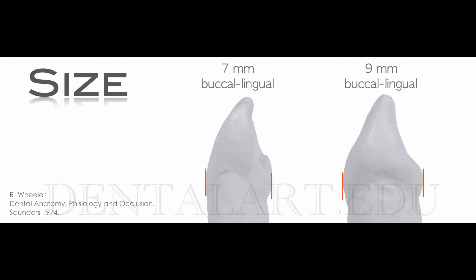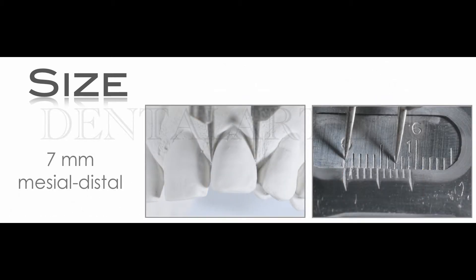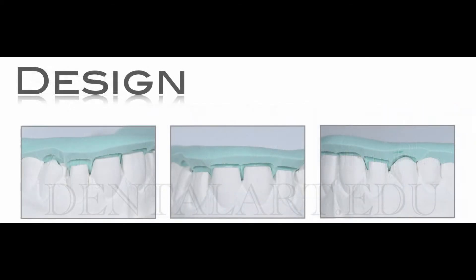We have to play more with the labial area since they are veneers. In the laboratory, after the diagnostic impressions, we developed the diagnostic model work. We took measurements and knowing that from 9mm we need to achieve 7mm mesial-distal. After the wax-up, we made silicon keys — two kinds: labial and palatal-incisal. With the palatal-incisal key, we check the spaces, the tooth length, and how we can manage the perimeter in its anatomical configuration.